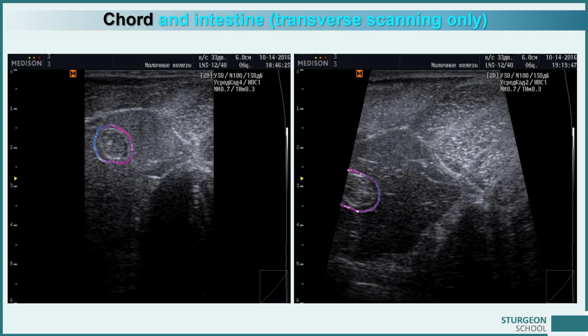When the transducer is correctly positioned, the image of the cord is blurred and located closer to the left or right edge of the sonogram. If you see the cord quite clearly and close to the center of the sonogram, it is likely that you have not placed the probe correctly.